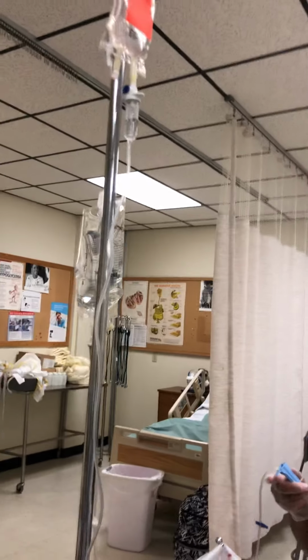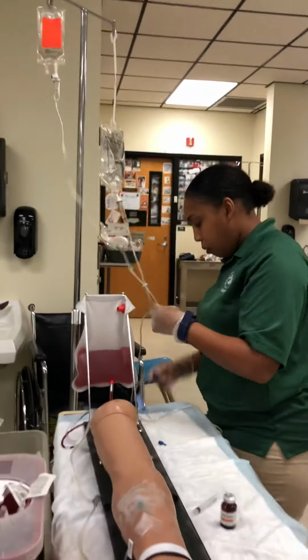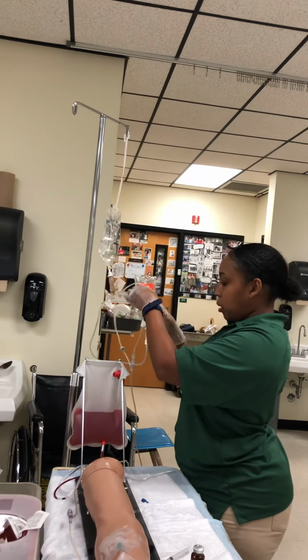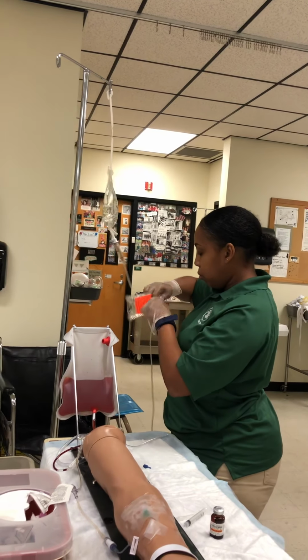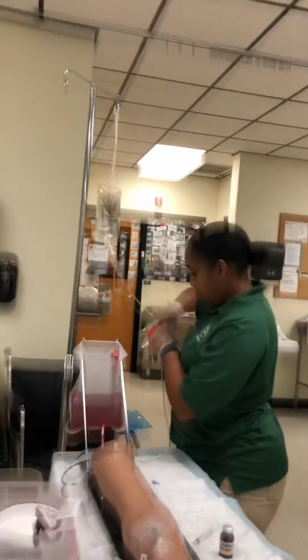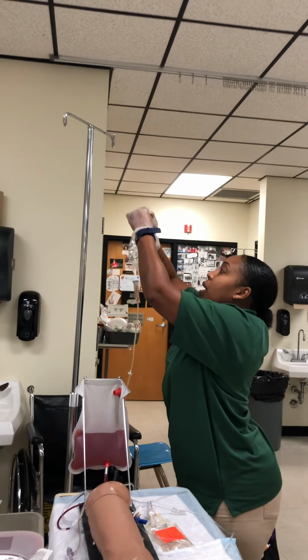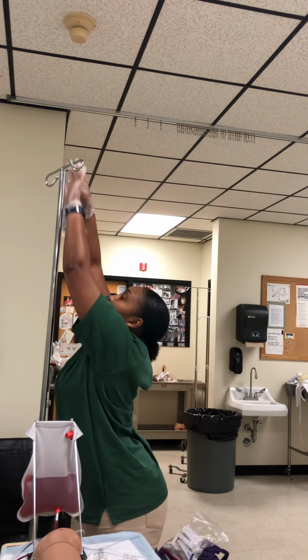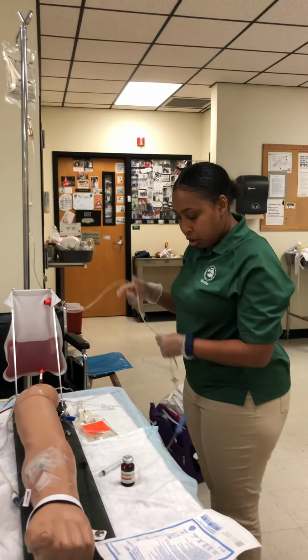Our infusion is complete, so now we're gonna close it off, clamp up our secondary tubing. We're gonna get ready to disconnect our piggyback secondary set. Okay, we're gonna disconnect. We're gonna take our primary and we're gonna raise it back up, and we're gonna adjust our primary flow rate back to the previous MD order. We're gonna regulate it. We're gonna put it on a pump at 100 milliliters per hour.